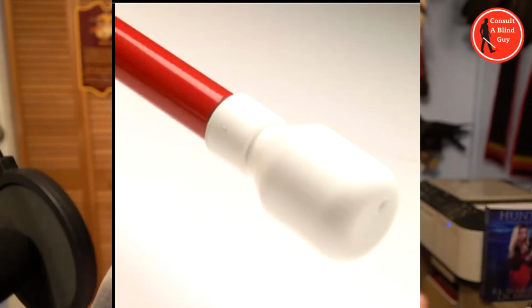And I will be getting more in the future to be able to show some of the different brands that are out there, as well as some of the different styles that are available from the different manufacturers other than Ambutech. And then, of course, I do not have a brand new one to show you, but the Marshmallow non-roller. It's the same thing as the roller tip, with the exception of it does not rotate as you use it like the others. They are strictly hook style stationary, and they do the same as the others.